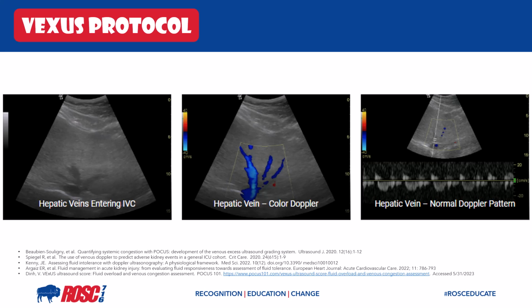And first, we're going to take a look at the liver. We're going to take a look at the hepatic veins. So first, you're going to obtain an image of the hepatic veins in 2D echo. Then you're going to apply color flow Doppler, and you'll identify the hepatic veins by blue color waveform. And this is because the blood flow is moving away from the probe.